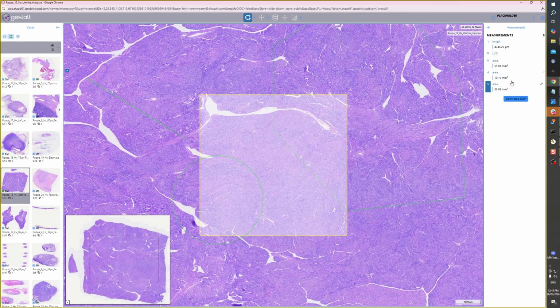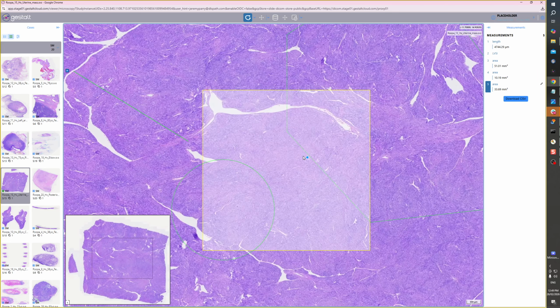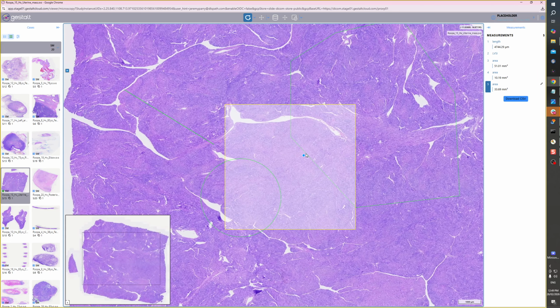If you were to download these with that function now, it would capture all those 5 annotations and put them in the folder over here. And then once you've done that, they would disappear, but you could then retrieve them each time you open the image by just opening that CSV folder, but at the moment it doesn't exist there. We haven't created one. We'll go through that when we've perfected it. That's how the image annotations work.